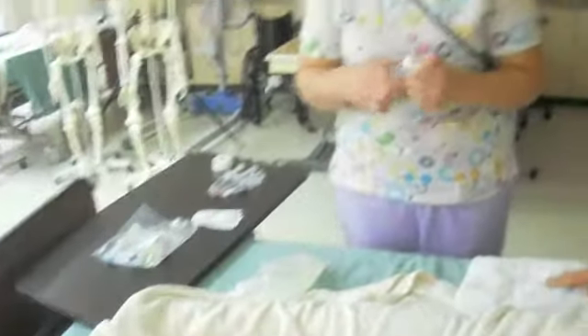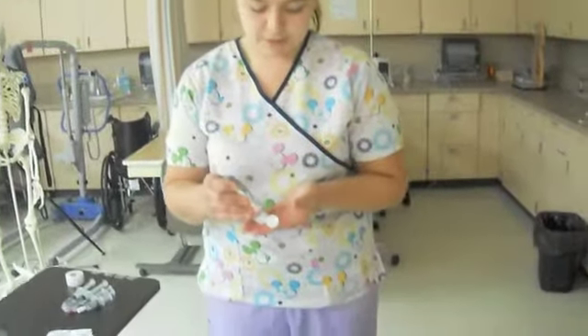Okay, so to start off, I'm going to first wash your hands and get yourself all ready.